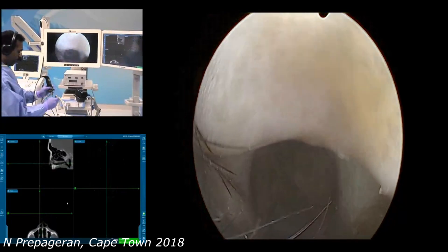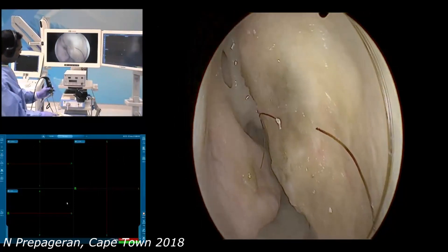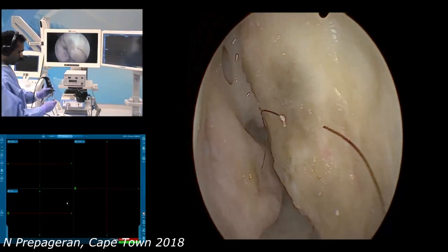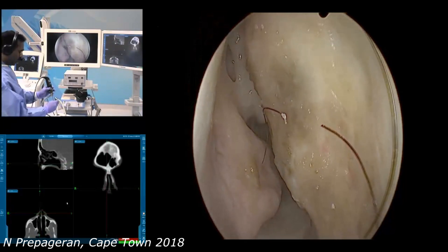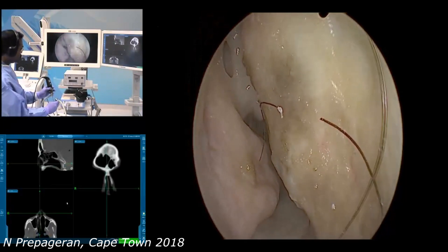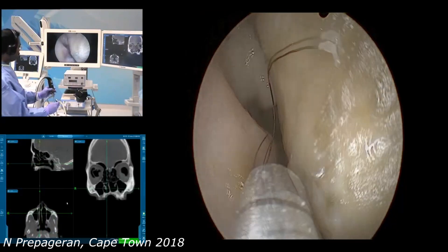Again, just to repeat: anchor the scope right at the tip of the nose so that it's held steady. Because the nose is quite compliant, that will give you a large space. And then for the suction or any other instrument, always withdraw your scope and follow the instrument inside.